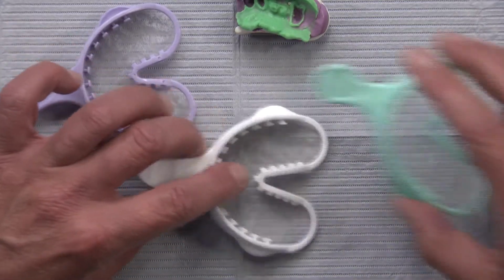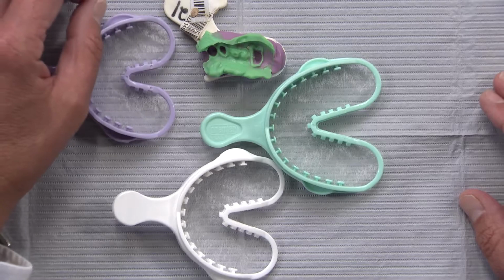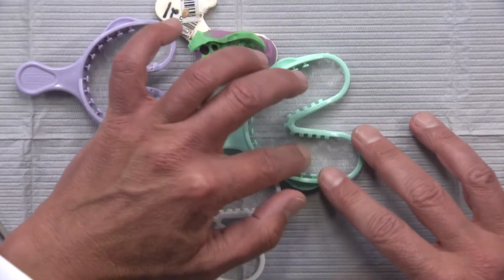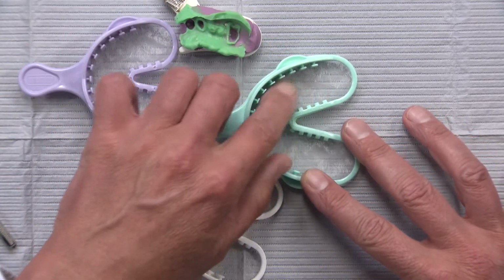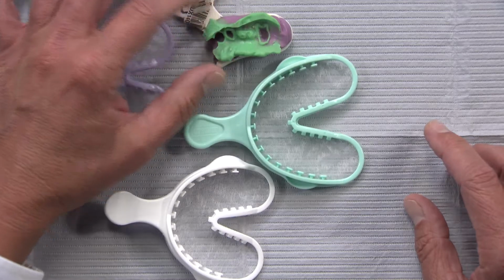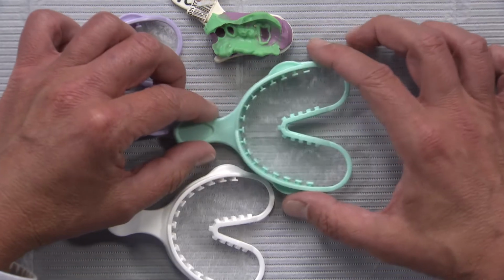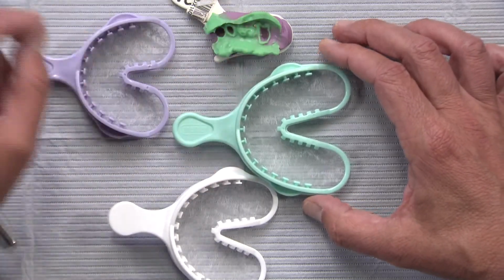There's a small, a medium, and a large. So if this doctor had said, well, I don't like taking 2 separate impressions, you could use an upper and lower. Instead of being just this small little thing like this, if you extended the impression material over to the other side, at least we would have all those other teeth on the other side. And yes, we'd rather use something a little more sturdy than a plastic tray like this for a 4-unit bridge.